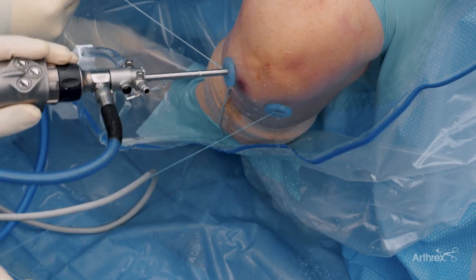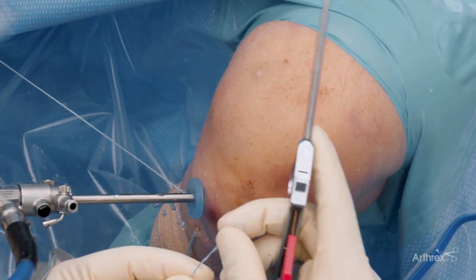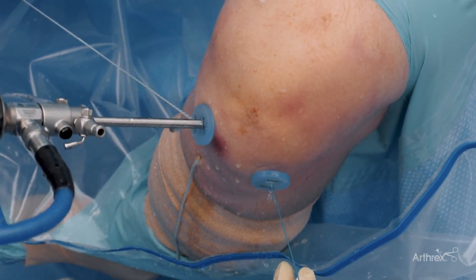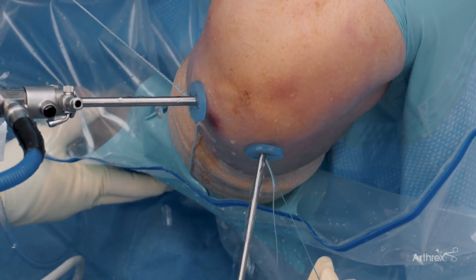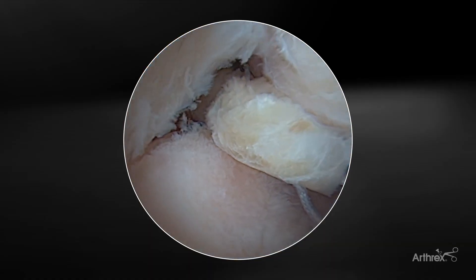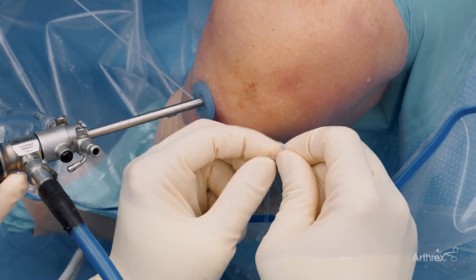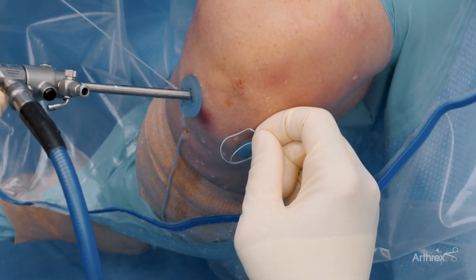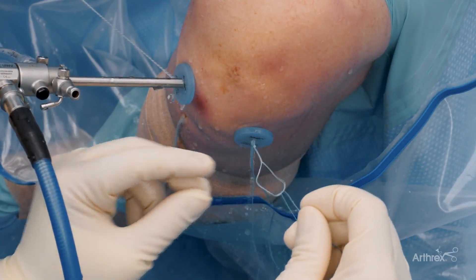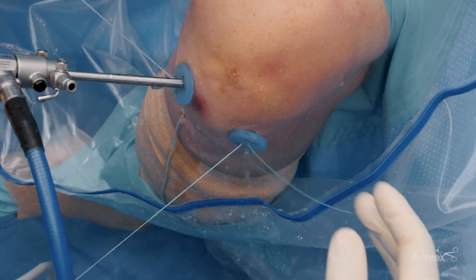We now have the first vertical repair suture in place, but we have to put another suture from top down to complete the vertical repair. We'll utilize the meniscus scorpion with a fiber link, which will allow retrograde passage of the suture for the vertical repair. The fiber link suture is loaded into the meniscus scorpion so that you can pass it from the bottom of the meniscus to the top, and then retrograde the suture down through the link. The right amount of tissue is grasped, keeping in mind you need a reasonable bite to accomplish the vertical repair. We're now going to load the fiber link with the vertical repair suture and shuttle it into the meniscus. This will be the first step in the Mason-Allen repair. The next step is to convert this one so we get this suture out of the way, but a key thing during conversion is to not pull it all the way in so you can still put the meniscus scorpion under the meniscus and finish the Mason-Allen repair.